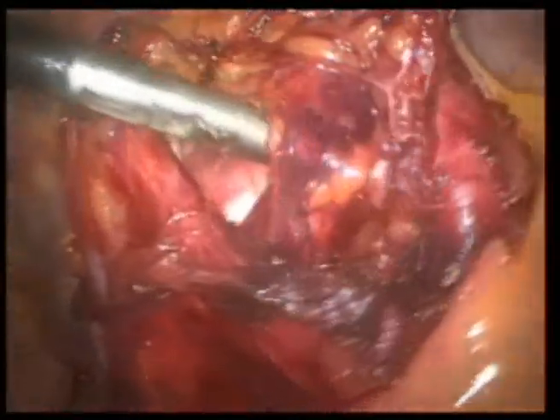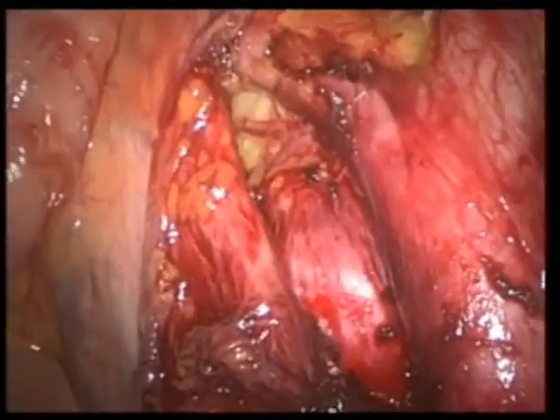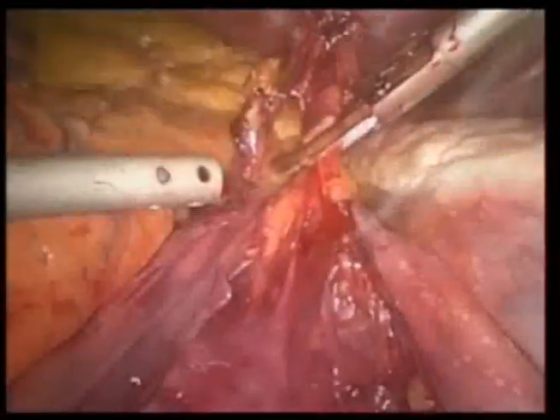The dissection continues cephalad with identification of the IMA. The left renal vein is seen here. Left periaortic lymphadenectomy above the level of the IMA is performed in this area. This is an overview of the left side of the periaortic region. Right periaortic lymphadenectomy is performed in a similar fashion. Attention is then turned to the presacral lymphadenectomy.